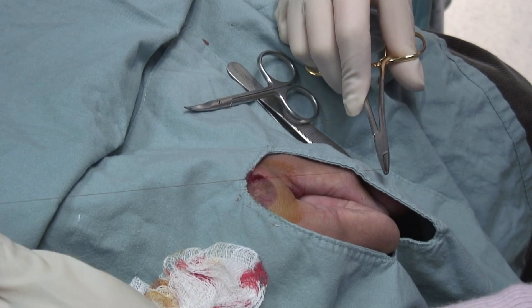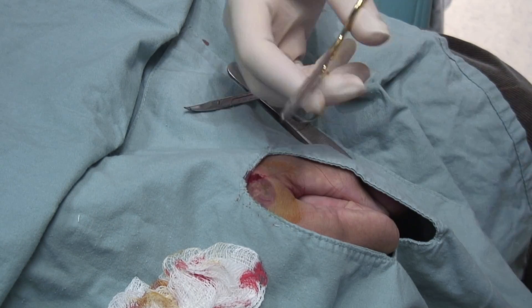A single interrupted stitch with 5-0 nylon or plain gut can be used to close the skin layer.